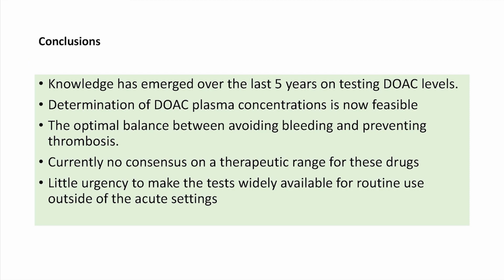In conclusion, knowledge related to direct oral anticoagulants is emerging, and determination of these drugs is now feasible in certain clinical cases, like emergency surgery or drug overdose.